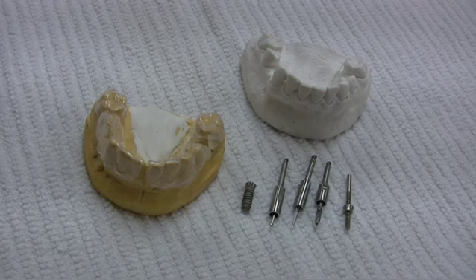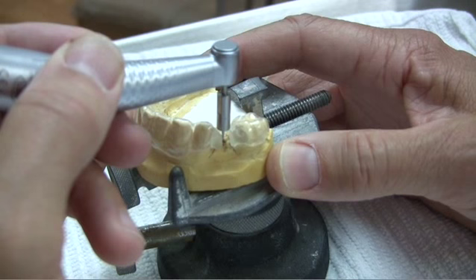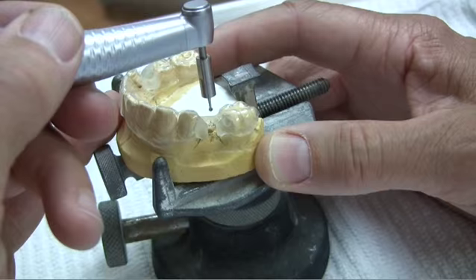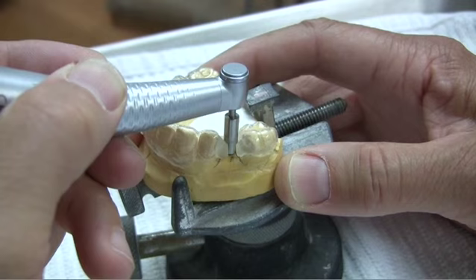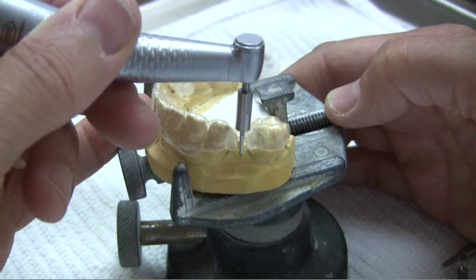Shown here on the left is the guide and the burrs with drill stops attached. The first burr, an O23 round burr — the drill stop is set on the burr to engage the guide before the burr begins cutting the bone. This will start the osteotomy in the exact center of the channel on the guide. Next, a pilot drill is used with a stop set to limit depth 4 or 5 millimeters into the bone. Note the slot in the side of the guide to allow easy access.